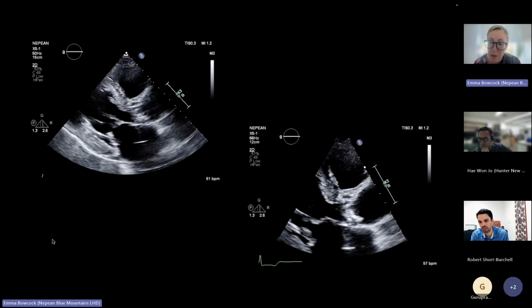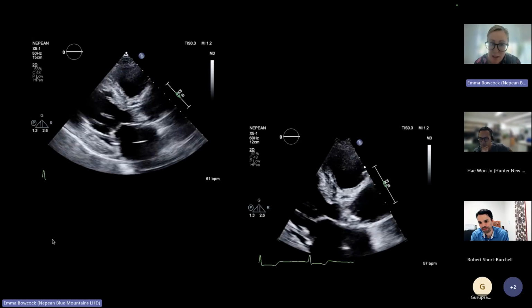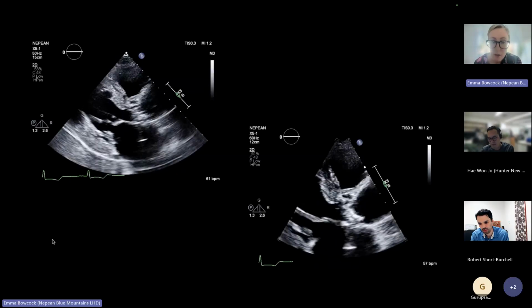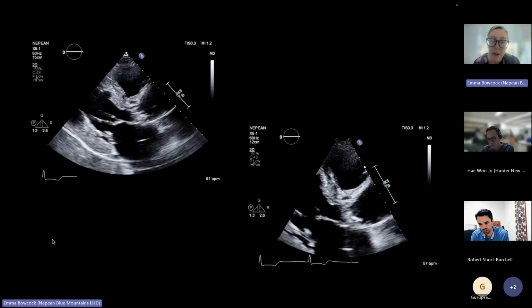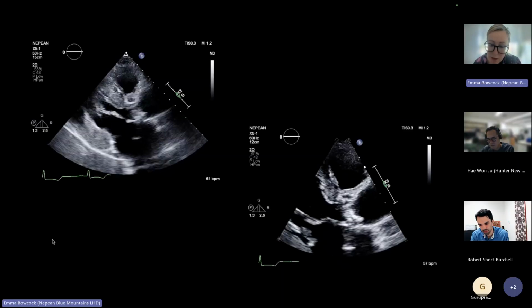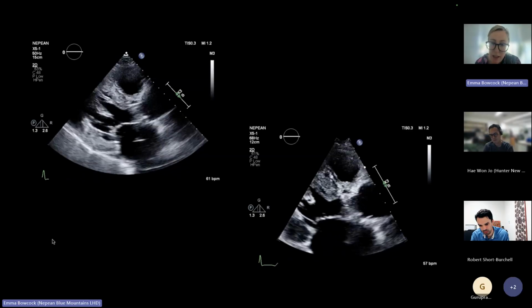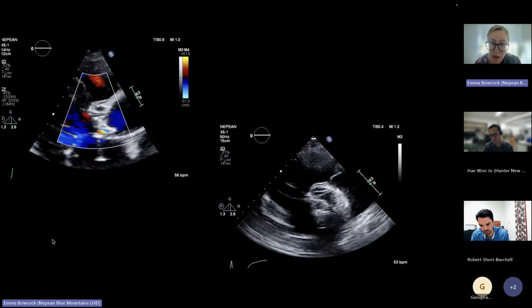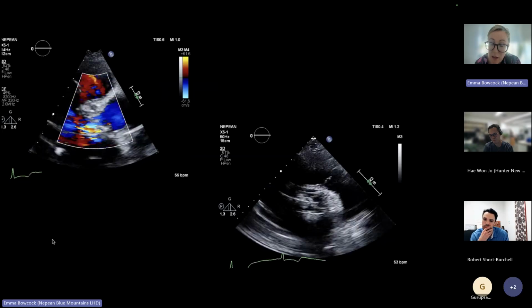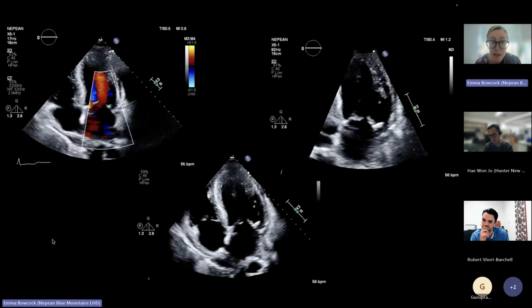He does have an abnormality, he has a bioprosthetic aortic valve. We didn't know what the footprint of the valve was, or what the baseline function was at this time. But it's definitely abnormal. There's increased velocity. There is a relatively normal DSI of 0.4, but you're absolutely right to comment on the accuracy of all of that. So let's come and have a look at this. We've certainly got flow acceleration as well as regurgitation, which is eccentric through that valve. Is that new or old? We don't know this at this time. He's not bacteremic at the time, but you'd certainly be worrying about those things as you mentioned.